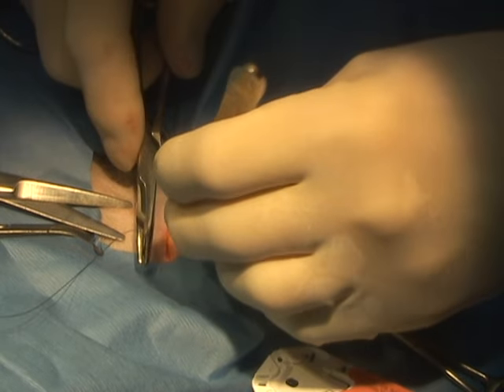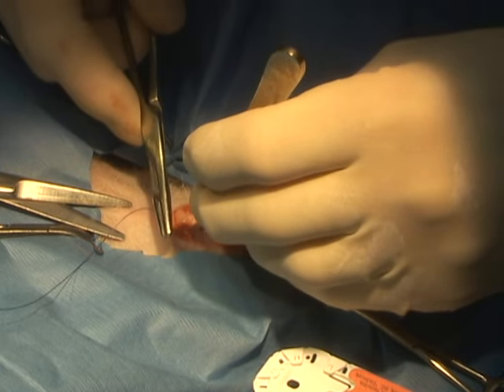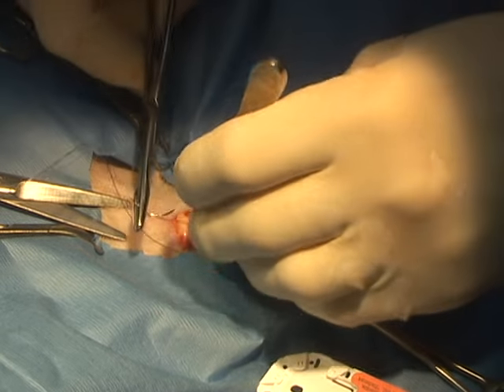And what we're going to do at the bottom is put a stay suture through the epididymis and then into the vaginal tunic across the base of the penis. This will make sure that we don't have any migration of the implant.